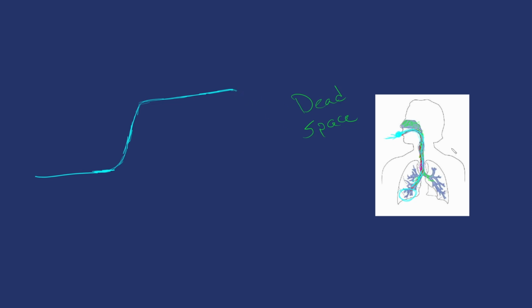All right, and then we start our next inspiration. As we breathe back in, that concentration of CO2 here at the mouth is going to drop off rapidly because we're no longer getting the high CO2 that we are breathing out, we're getting the environmental CO2 that's coming in. So we're going to have this drop off, and then we just kind of continue the cycle. And this right here is our capnography wave.